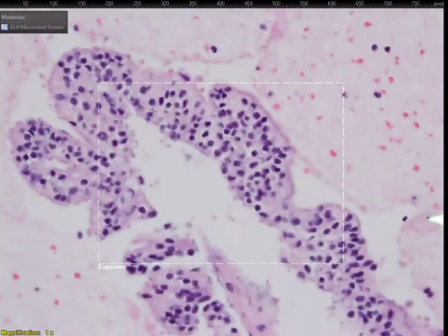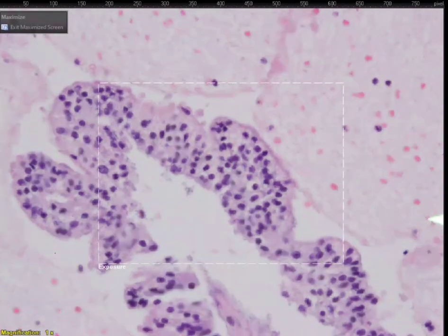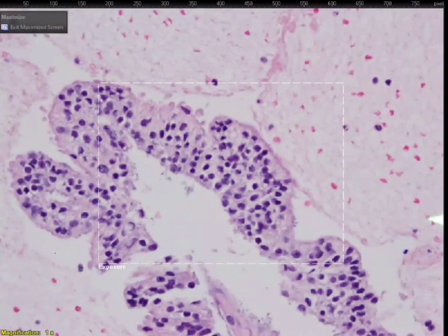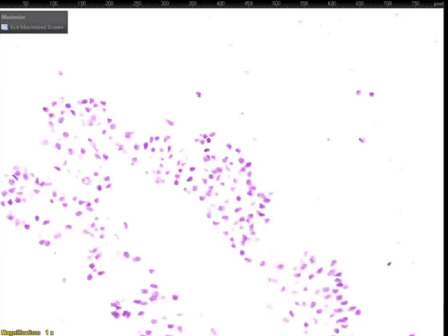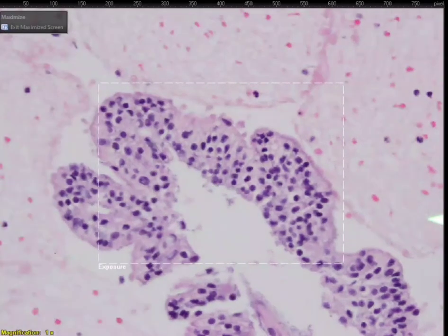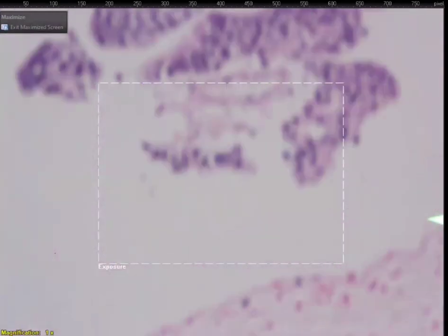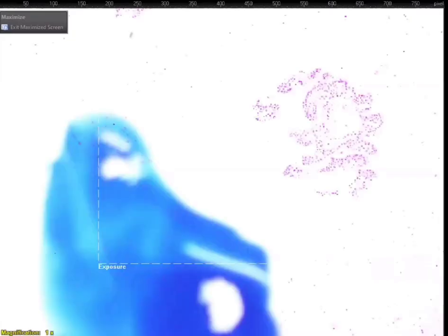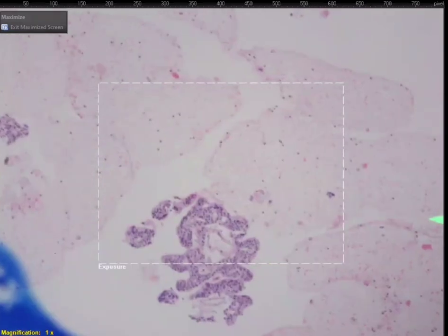Very good point. Great observation there, Dr. Mushtaba. Thank you. Okay, very good. Now with renal cell carcinoma, if it was, you would also see endothelial nuclei, no? Clear cell, maybe. But definitely good to add to the differential. It's definitely got a very papillary look on this thing. Okay, we got a bunch of differentials. Let's see what we call this thing.